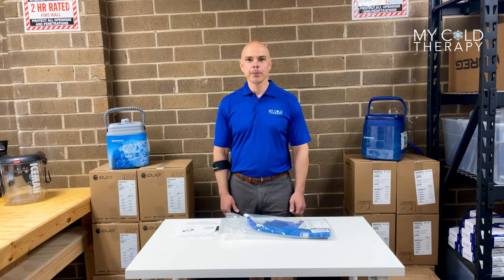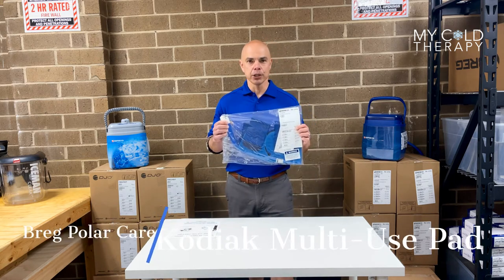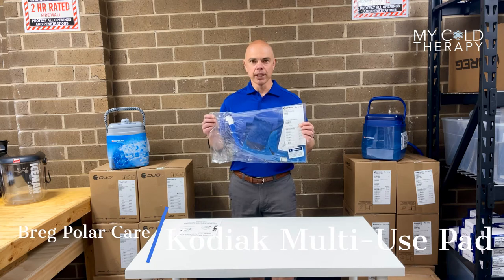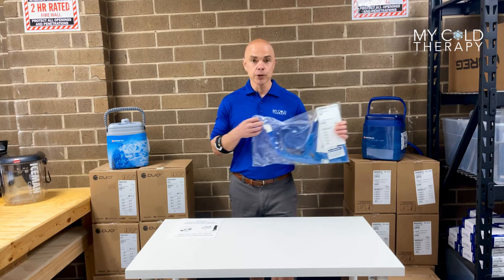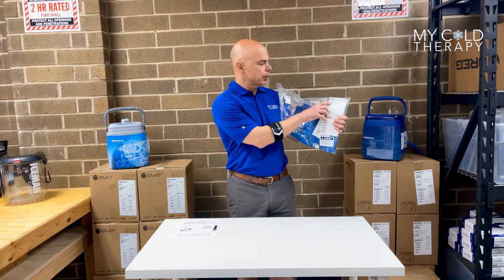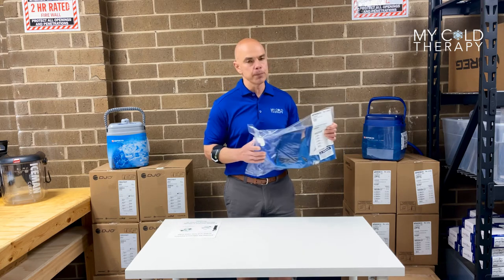Hi, my name is Steve from My Cold Therapy and welcome to our continuing series on the Kodiak Intel Flow Pads. In this case today we're going to talk about the Kodiak Multi-Use Pad. Please take note that every pad that comes in the mail is going to come in a sealed plastic bag. First thing you want to do is check the part number on the front — in this case it's 10240, that way you know you have a multi-use pad.